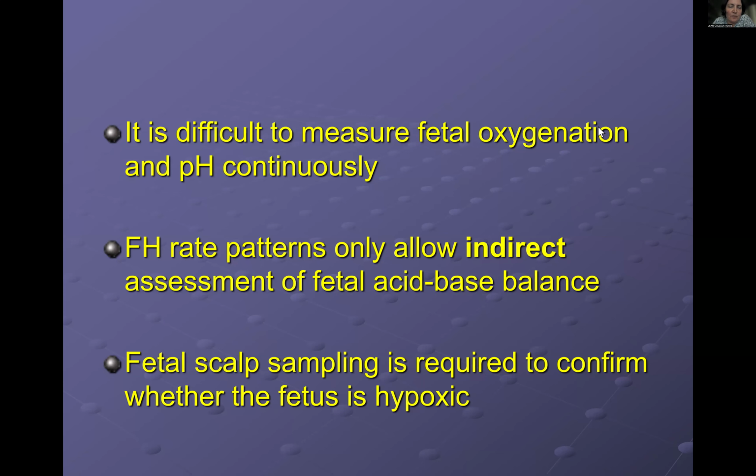I mean, if you were to directly measure the oxygen levels in the fetus, that's more invasive. It is possible to do it by applying an electrode to the fetal scalp, or else literally making a nick in the fetal scalp during delivery, taking a sample of blood from the fetal scalp and measuring the oxygen levels there. But of course, it's invasive.